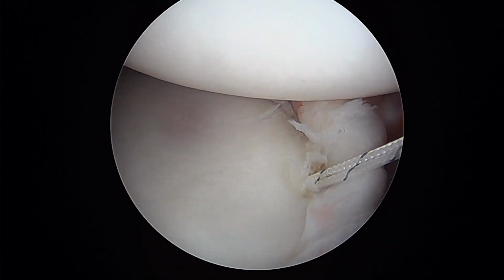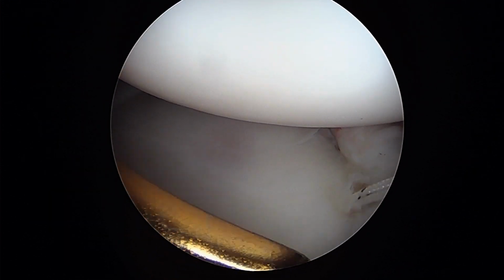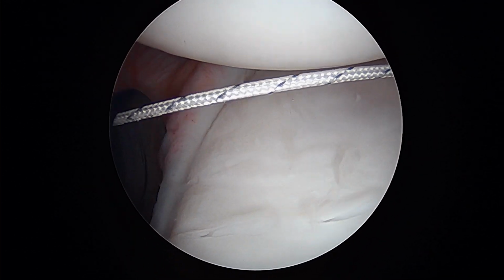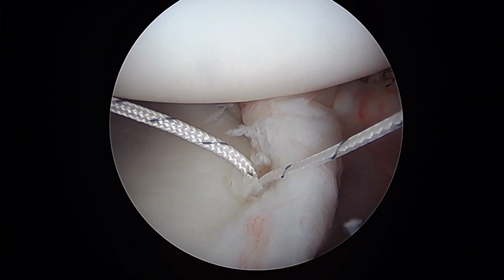Okay, there's the next one. We're going to take our crochet hook. We're going to take one of the sutures out posteriorly like we showed you before. And now we're going to put a grasper in the back, turn to the left in the front.